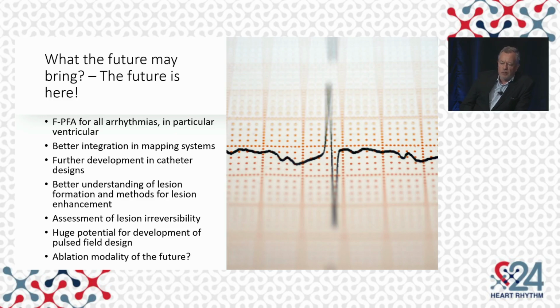There'll be further development in catheter design and pulse field design, but we also need a better understanding of lesion formation and methods for enhancing those lesions. And very importantly, a method of assessing lesion irreversibility. But I remain a believer that this will be an ablation modality of the future.